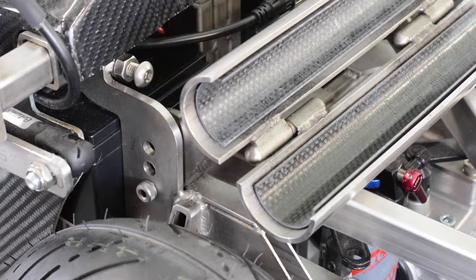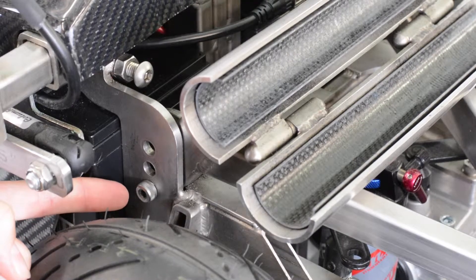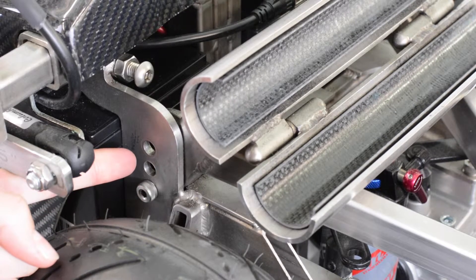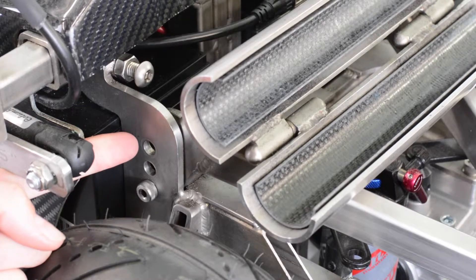To configure the ZX-1 for a different wheel diameter, all you have to do is move this bolt here. This unit is set up for a 24 inch configuration, as seen by the bolt being in the bottom hole. For a 25 inch configuration, you would simply adjust it to the middle hole, and respectively for a 26 inch to the top hole.